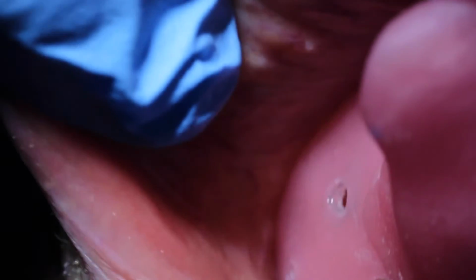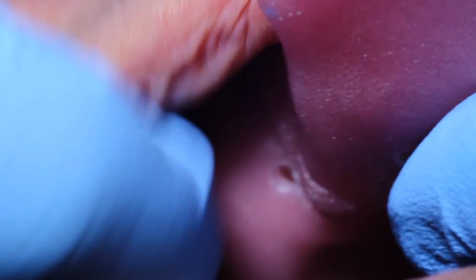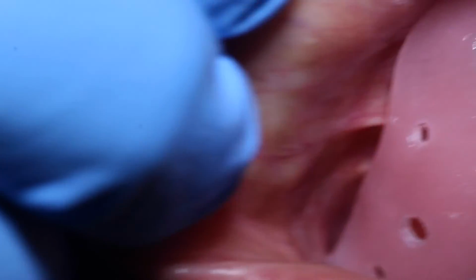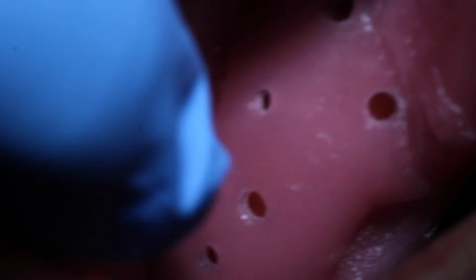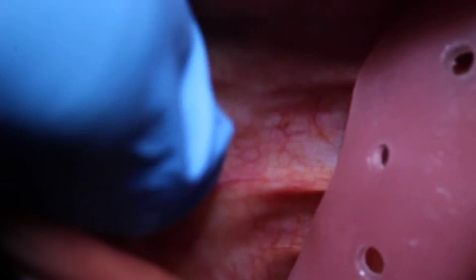Checking out the posterior most part is actually the most difficult. You need a mirror, you need really good light, but it's super important. See here, I am still bumping my tray out of the way with the lip, and I need more space for those frenums there. So I'll show you. I'm going to adjust it in just a moment. But I mean, I probably spend a good 15 to 20 minutes just adjusting my custom tray before I get started. I mean, per arch.